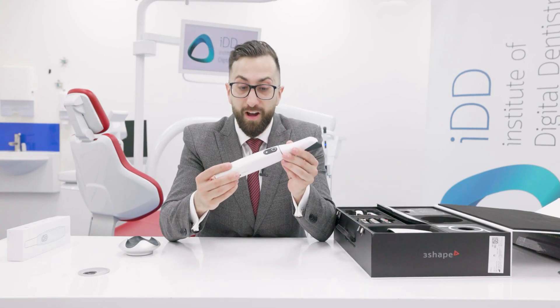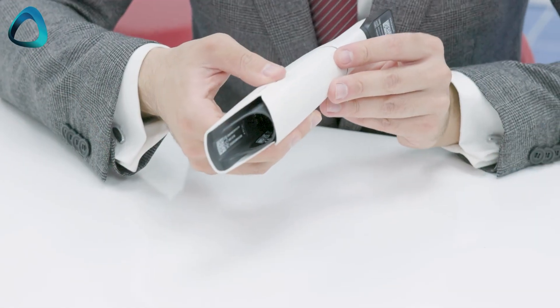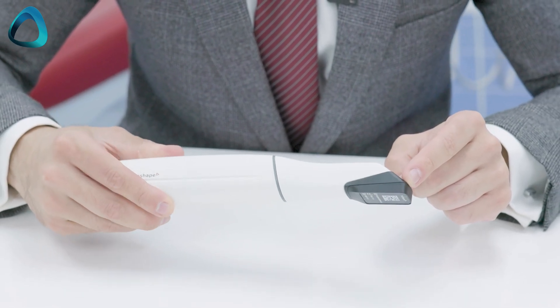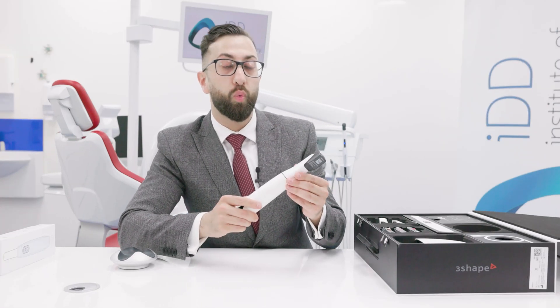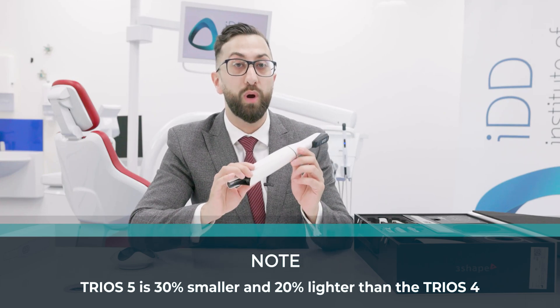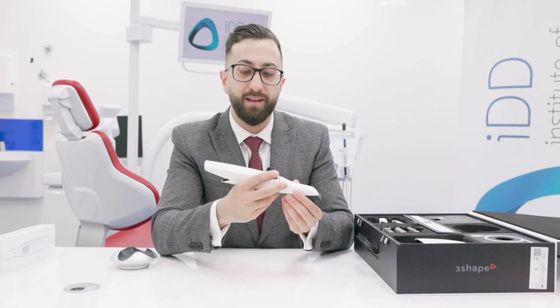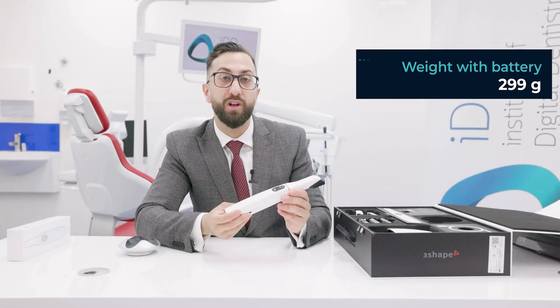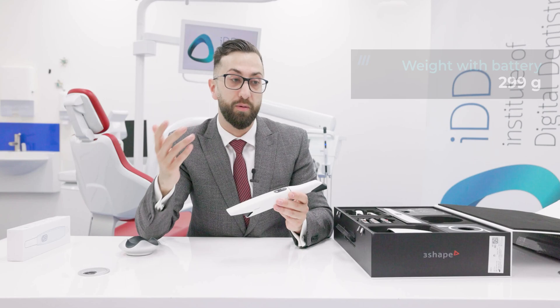This is the Trios 5 in all its glory. It's a really good looking scanner — super high-tech and futuristic. It comes with this protective cover, and three scanner tips are included. One key thing to note is that the Trios 5 is 30% smaller and 20% lighter than the Trios 4, making it a significantly smaller and very ergonomic scanner. It weighs 299 grams with the battery installed, which makes it one of the lightest scanners on the market.